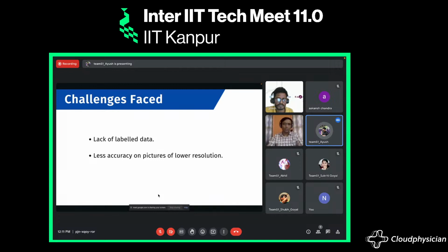Yeah. And when you crop that out, then it's less. So even if it is less, I think you will get more than 70% of the area because the monitor is not very small. So in a few images you might face that problem, but it's not like the data is low resolution. It's not exactly low resolution, but in the cases where it was low resolution, it wasn't able to detect that properly.